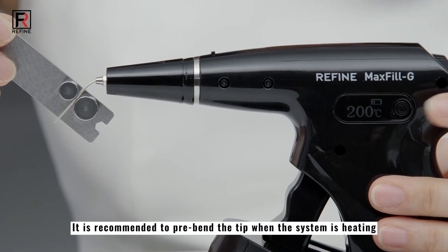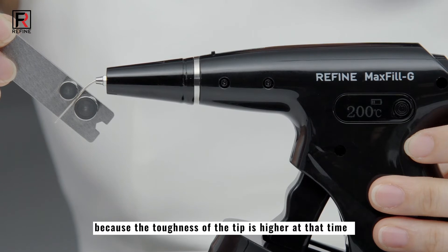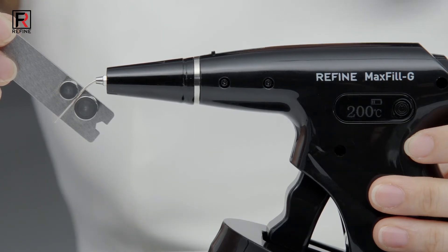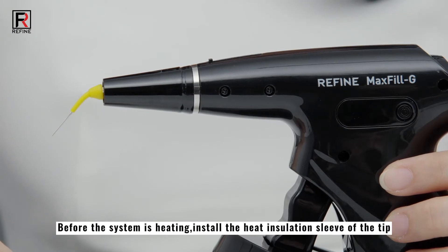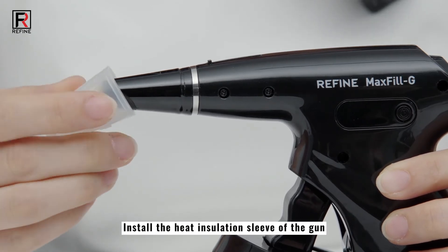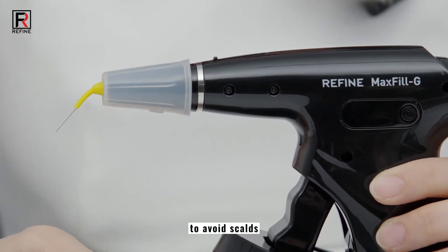It is recommended to pre-bend the tip when the system is heating, because the toughness of the tip is higher at that time, to lower risk and extend tip life. Before the system is heating, install the heat insulation sleeve of the tip and the heat insulation sleeve of the gun to avoid scalds.